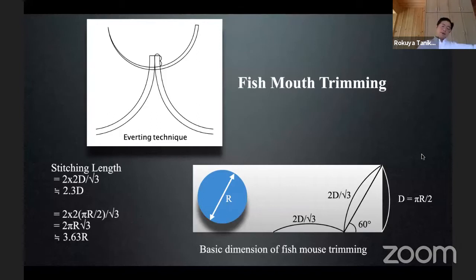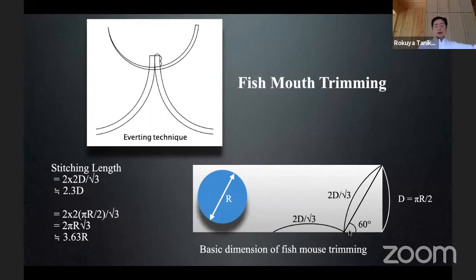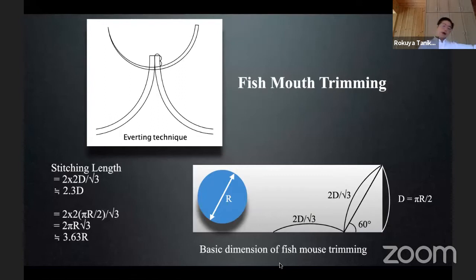Another important principle is the fish-mouth trimming. At the end of the donor, I always cut the donor wall at a 60-degree oblique cut with the same-length cutting up. This length can be calculated: the length is two times the shrunk diameter divided by root three, so this total length is four times the shrunk diameter divided by root three — approximately 2.3 times the shrunk diameter.